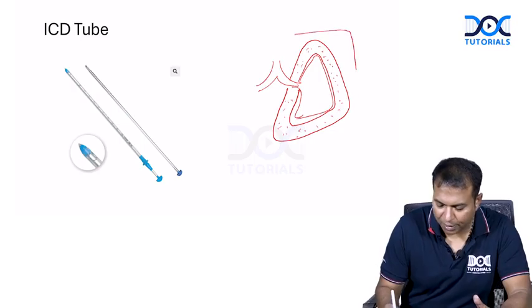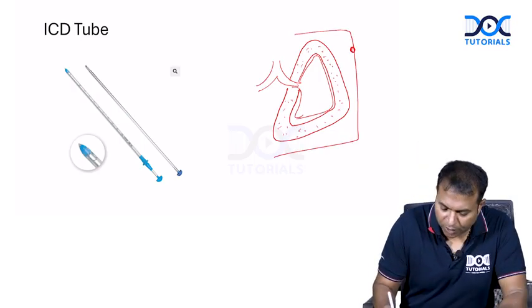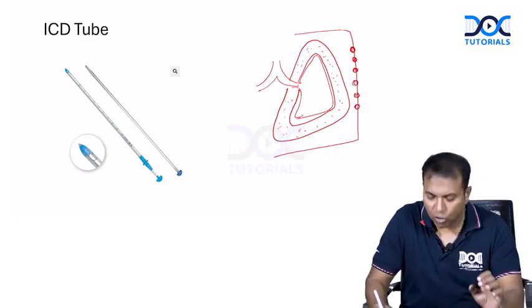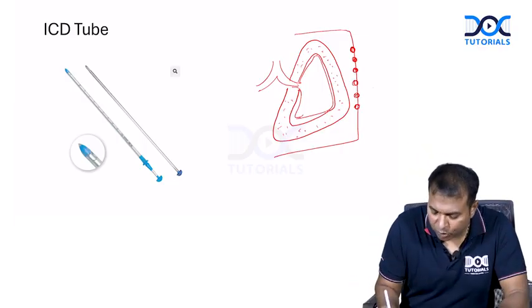And this is the rib cage. This is a rib cage. So these are the ribs, 1, 2, 3 like that. There are many ribs. So please understand the intercostal drainage tube, where it is put. You are going to put the tube into this space only.